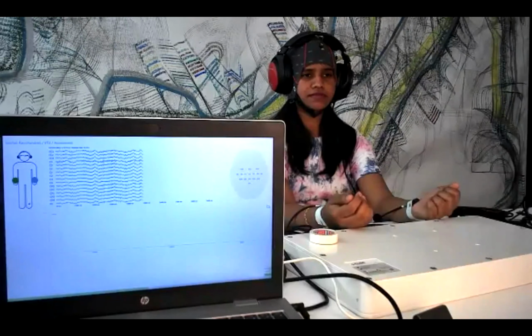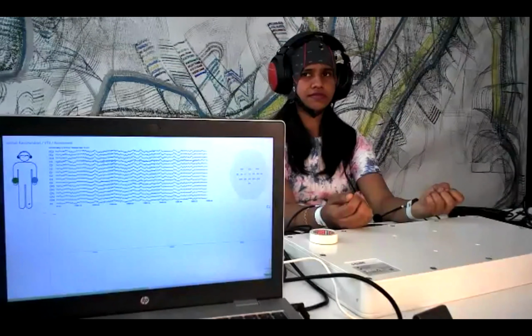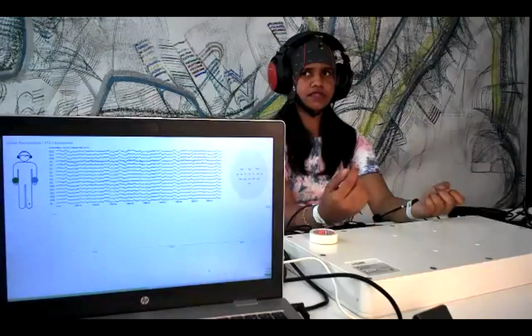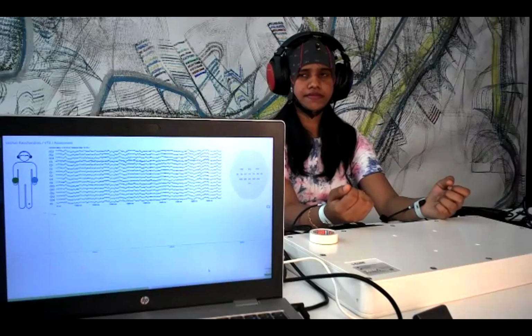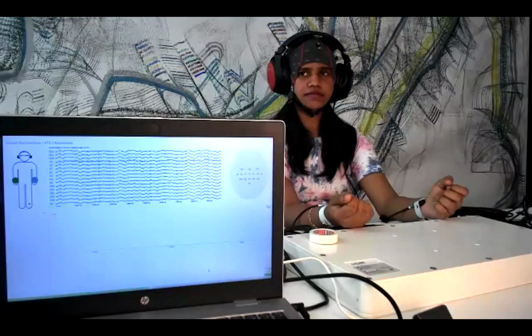So as I also mentioned a little bit before, for the running phase, we need to change the focus from the right to the left. So at the beginning, you need to count the vibration on the right. It will give you an auditory instruction, right wrist. And then after 1.5 minutes, you will switch to the left. You need to count on the left wrist.